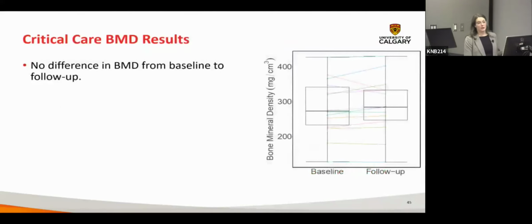Spoiler alert, we actually saw no differences in BMD, which was actually quite disappointing. Kind of sad to say we're disappointed we didn't see differences, but we don't really know why yet. So we were a little surprised by this. It could just be that 14 days was not enough time, but based on our sample, that was something that was attainable to look at.